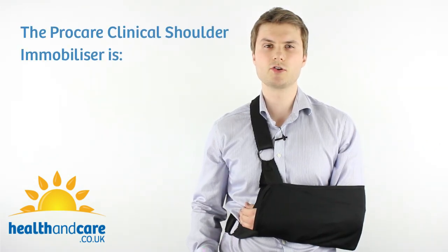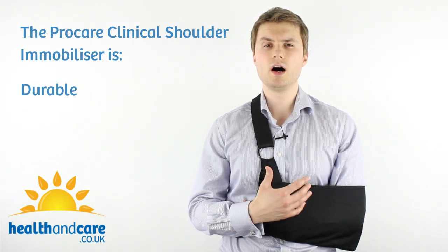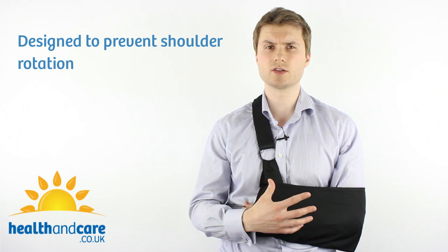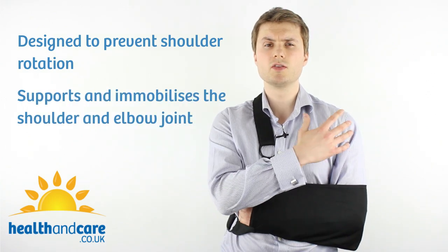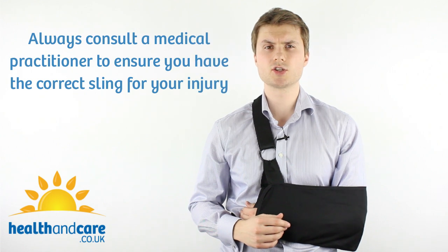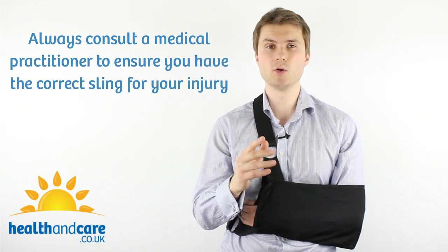The ProCare Clinical Shoulder Immobiliser is a durable, hard-wearing and very comfortable shoulder immobiliser. It's designed to prevent shoulder rotation, so it supports and immobilises the shoulder joint and the elbow joint. Always consult a medical practitioner to ensure you've got the right sling for your particular injury.